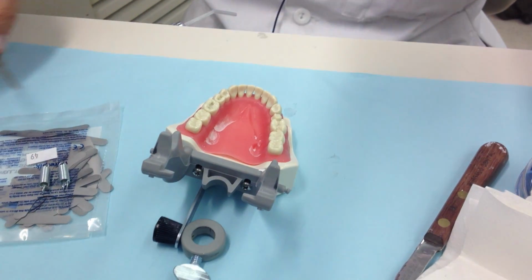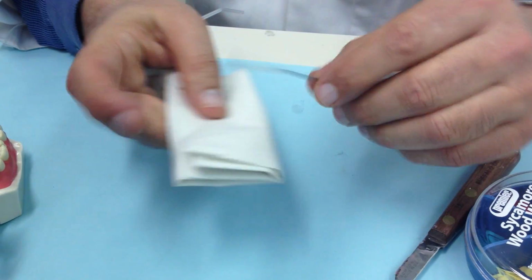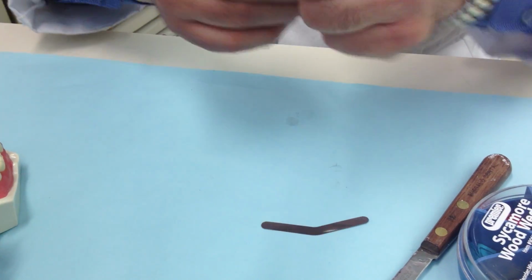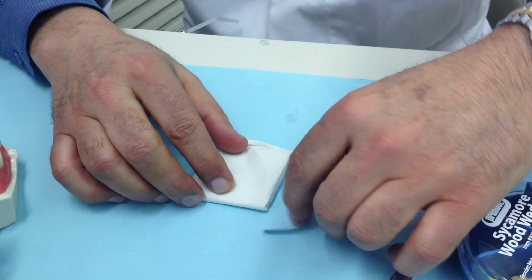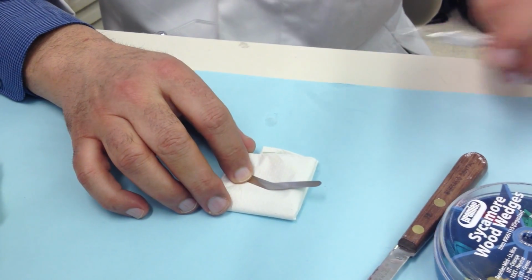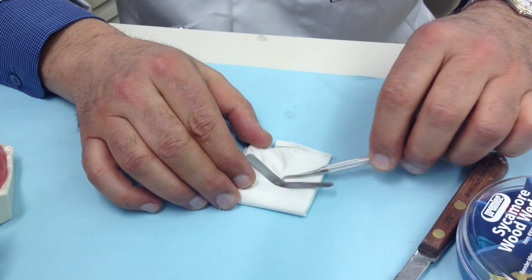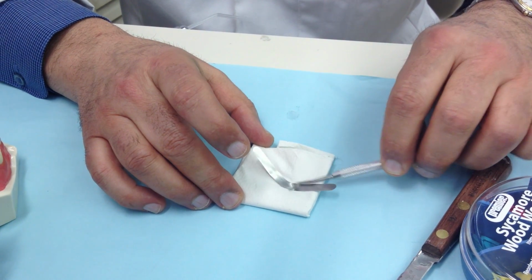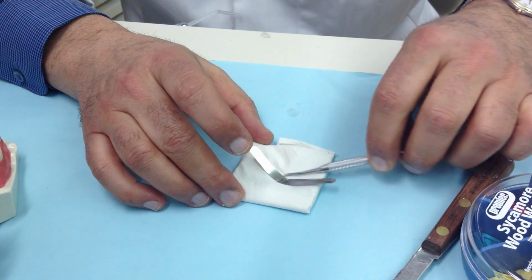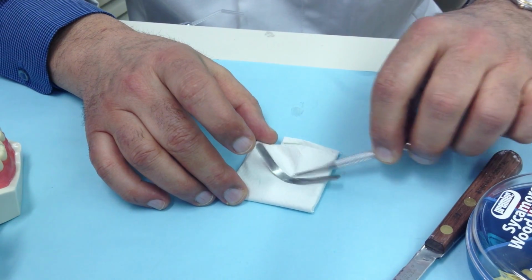Now I have chosen this one over here. Before I place that into the retainer, usually what I do, I get either a burnisher or a large spoon excavator. I go over here and burnish it. As I burnish it, you can see this become rounded, correct? Just I burnish it, I form this one.